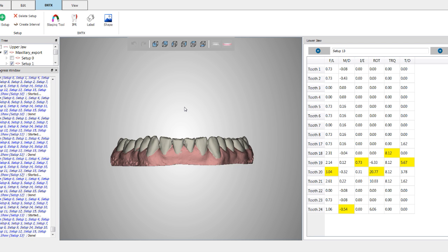If I have very small teeth, then I'm going to lean towards placing attachments because you need to have as much surface area as possible for the appliance to grab onto.